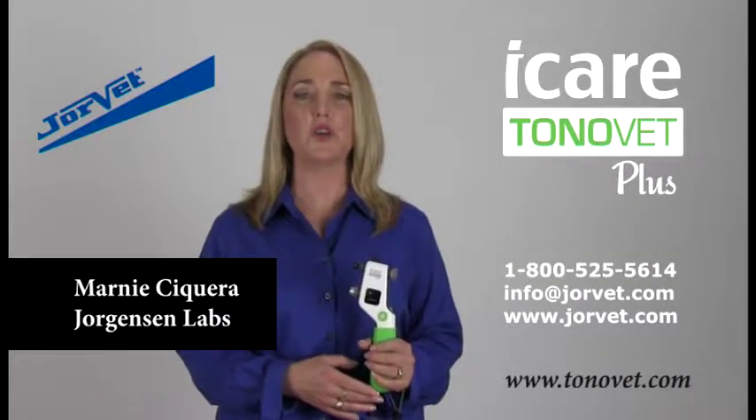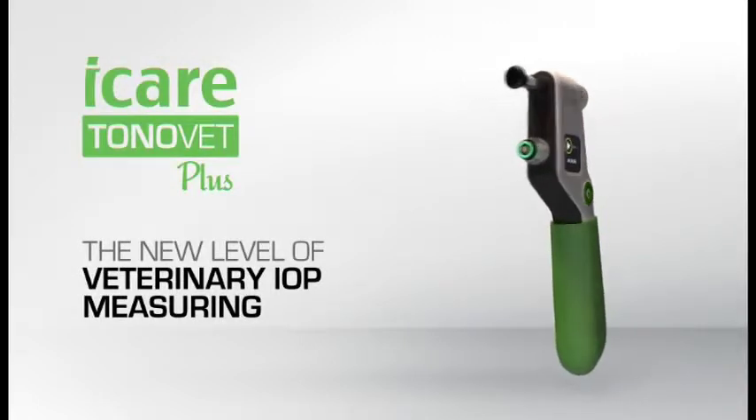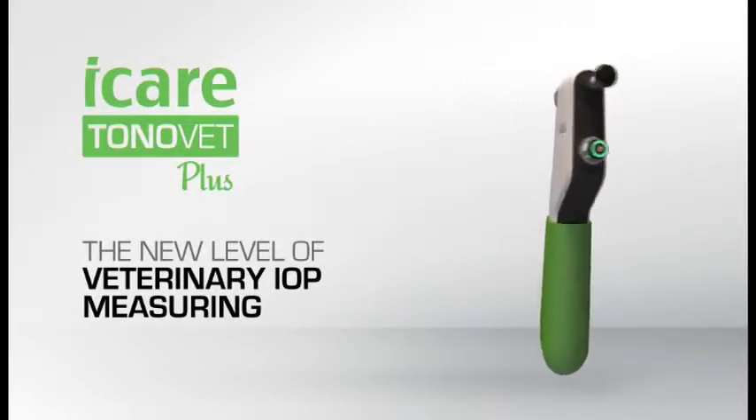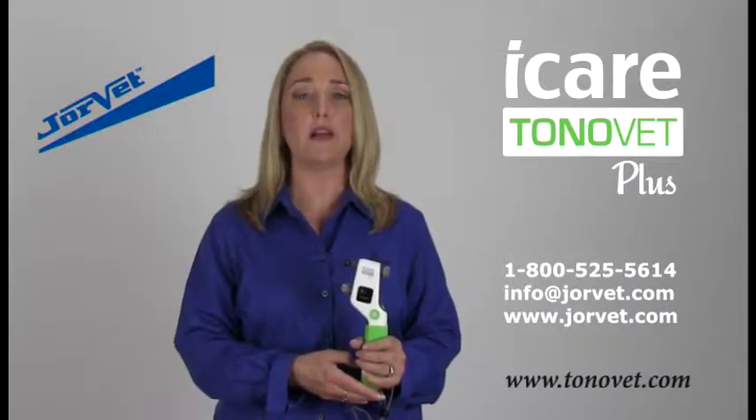I'm here today to introduce to you our new tonometer, the EyeCare ToneVet Plus, which is the next generation of the ToneVet. This device allows for quick, easy, and accurate eye pressure measurements.